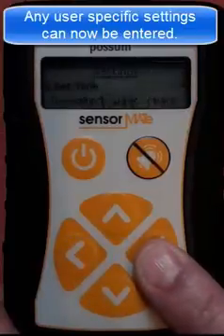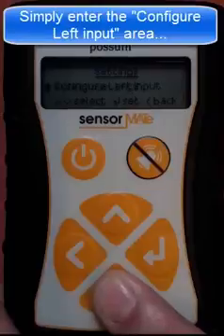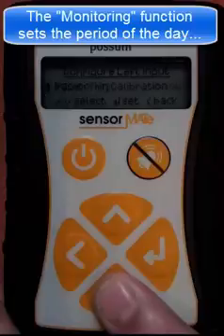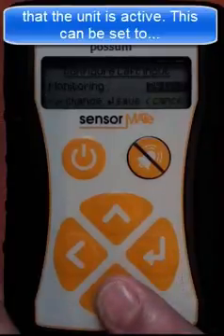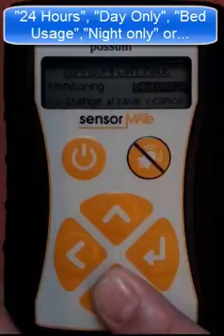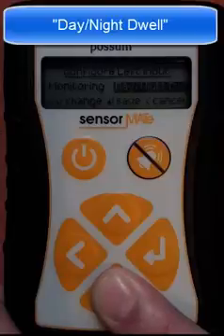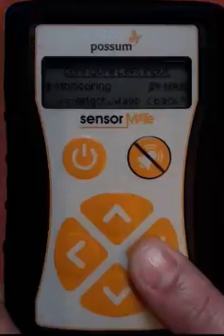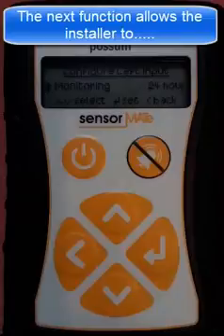Any user specific settings can now be entered. Simply enter the configure left input area, then scroll to the monitoring setting. This function sets the period of the day that the unit is active and can be set to one of the following modes: 24 hour monitoring, day only, bed usage, night only, or day night dwell. If the unit is being used to monitor not in bed by or not out of bed by times, then select bed usage.